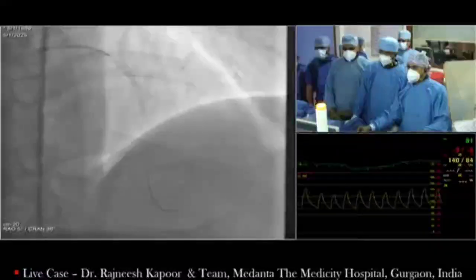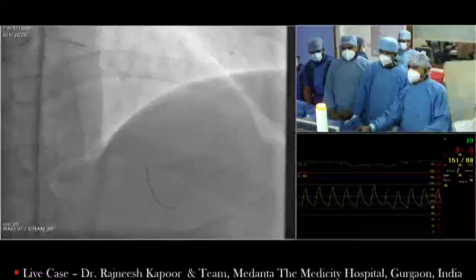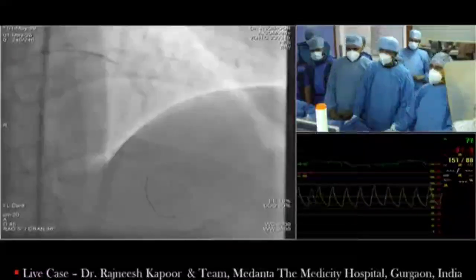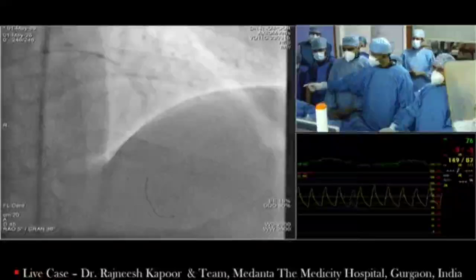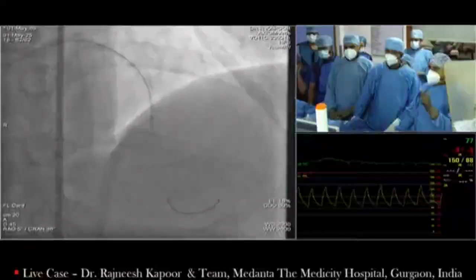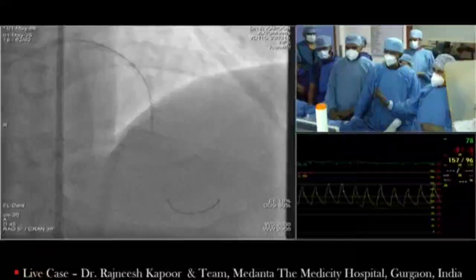Maybe we can let Dr. Kapoor work. So as I mentioned, we tried getting the orbital down. Show the shots, but the orbital nose cone was getting stuck at the same point.